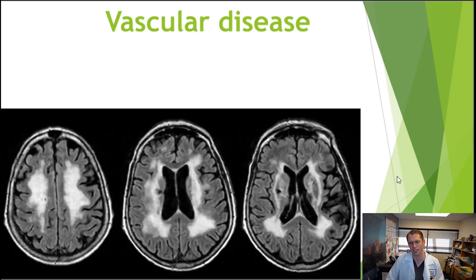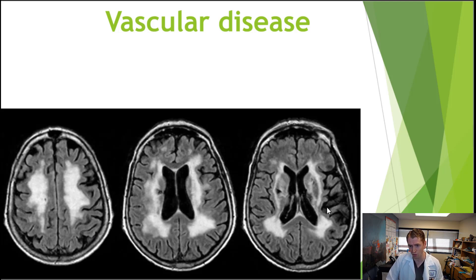Here is another example of an MRI of someone with advanced vascular disease. This particular individual had rapidly progressive cognitive impairment due to uncontrolled hypertension, known as Binswanger's disease. You can see extensive subcortical white matter disease, periventricular capping, involvement of the external capsule on both sides, and some areas of FLAIR suppression, more consistent with infarct than demyelinating disease.